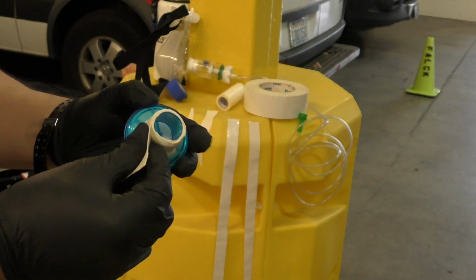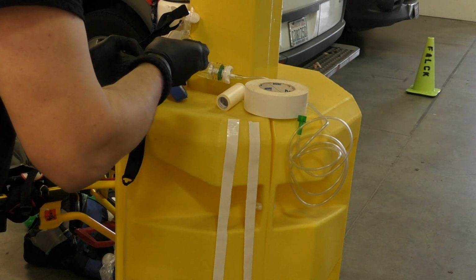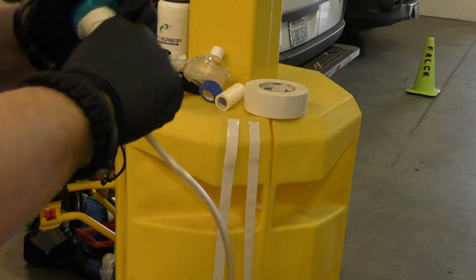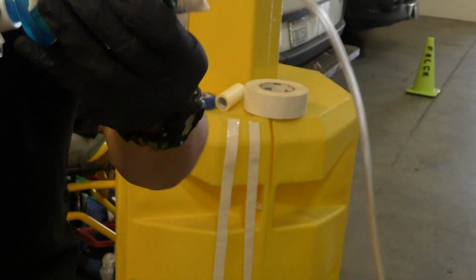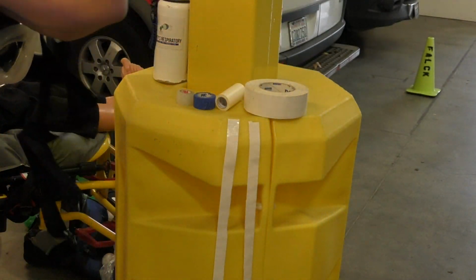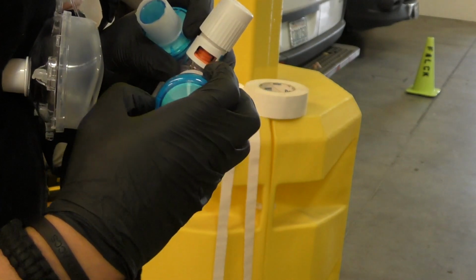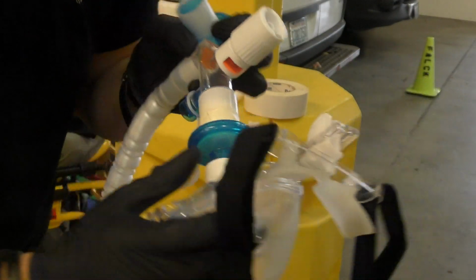I'm going to wrap it tight, like that. And then we'll put the last parts of this on there. Again, it doesn't have to be perfect, but that should fit on this. There we go, it's a tight fit. That fits, it goes on the mask, okay? If you feel uncomfortable that it might come off, this probably won't, it has a rubberized tape on it, but go ahead and put a little piece of tape on the outside. And just to show you, that fits perfectly well on this one as well. There we go, and we have an airtight seal.